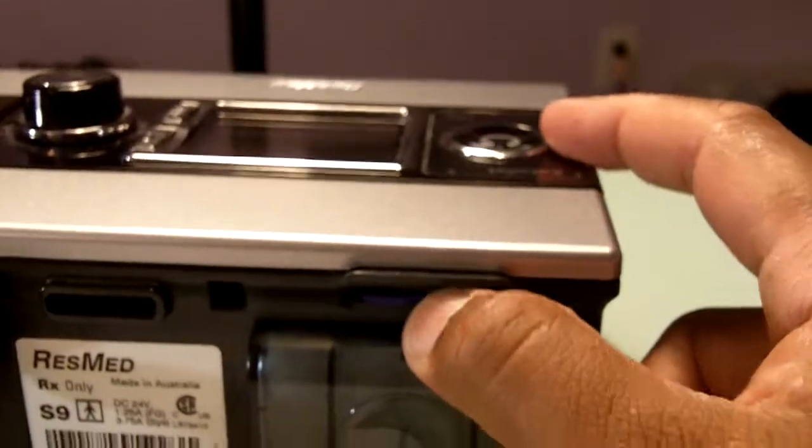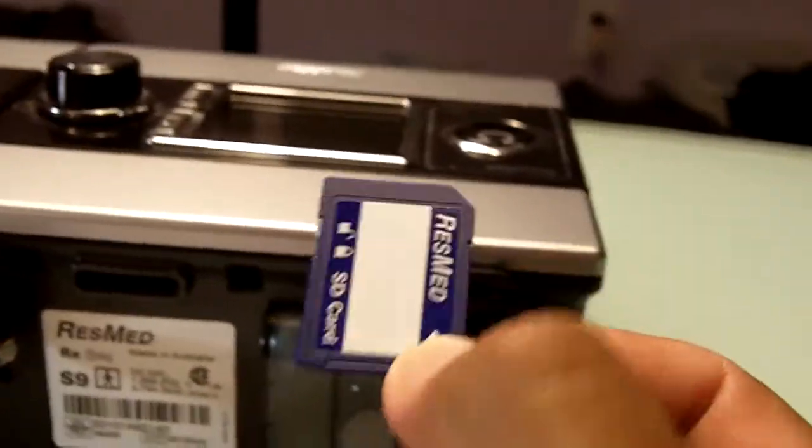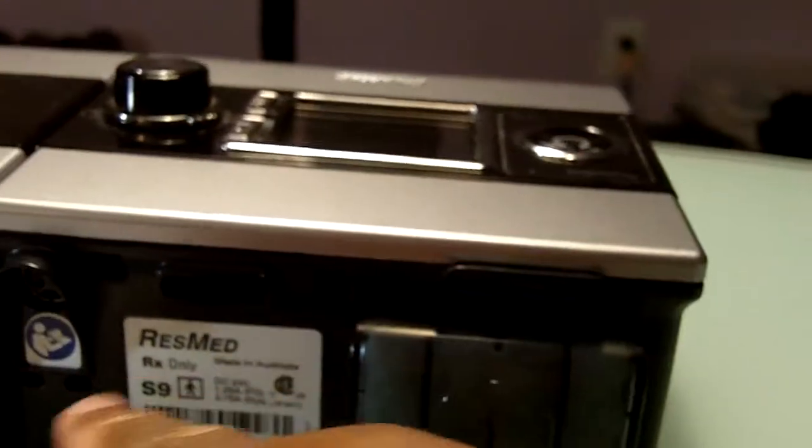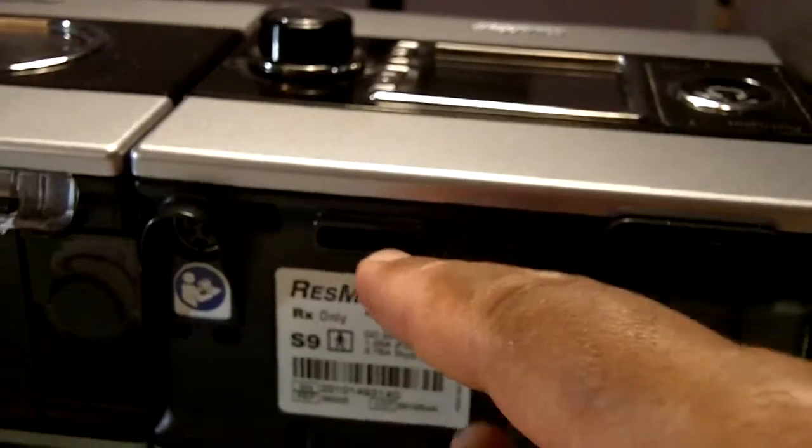The ResMed uses the same technology. They have an SD card, and they can also attach a wireless modem here to transmit the data.